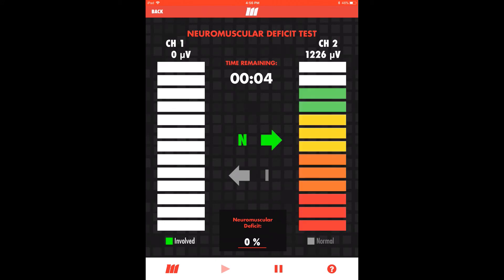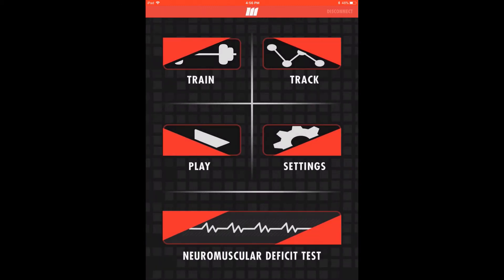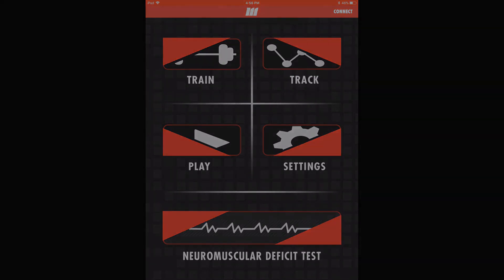In this demonstration of the test, the involved muscle exhibits a 14% deficit in EMG activity as compared to the healthy side. The goal is to recover the involved side to exhibit as little deficit as possible. Returning to home and disconnecting our mTrigger unit from Bluetooth, we conclude our walkthrough of the mTrigger Biofeedback System application. Thank you for taking the time to get to know mTrigger. Keep an eye on the blog for more tips, insights, and applications, and we thank you for being a partner in innovation.